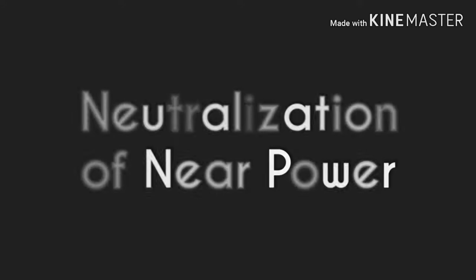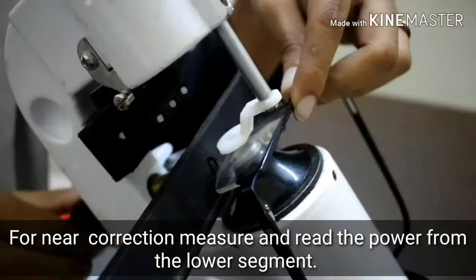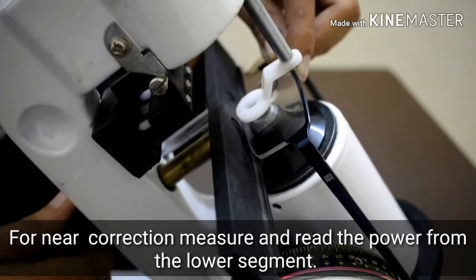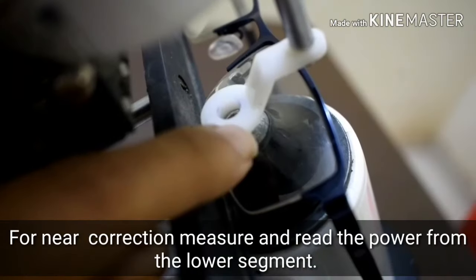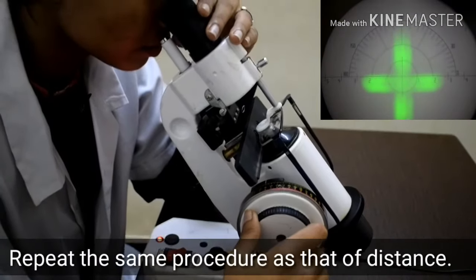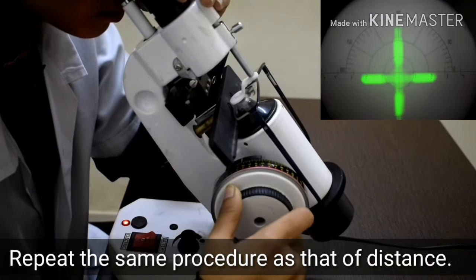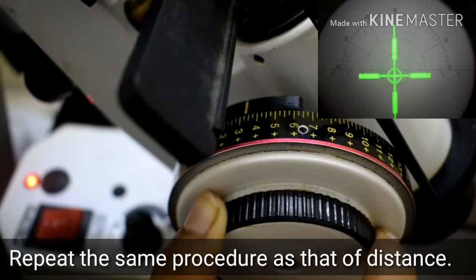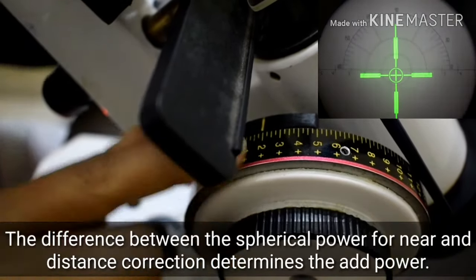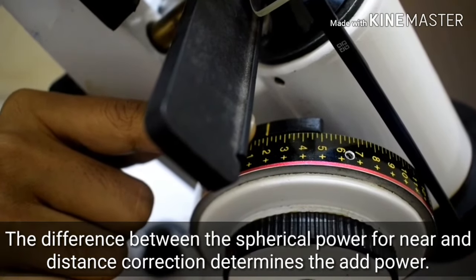Neutralization of near power. For near correction, measure and read the power from the lower segment. The difference between the spherical power for near and distance correction determines the add power.